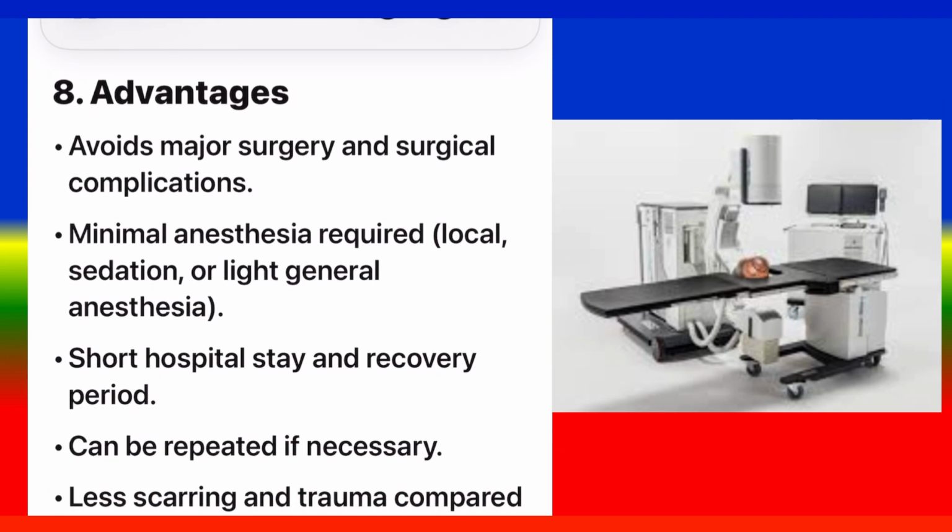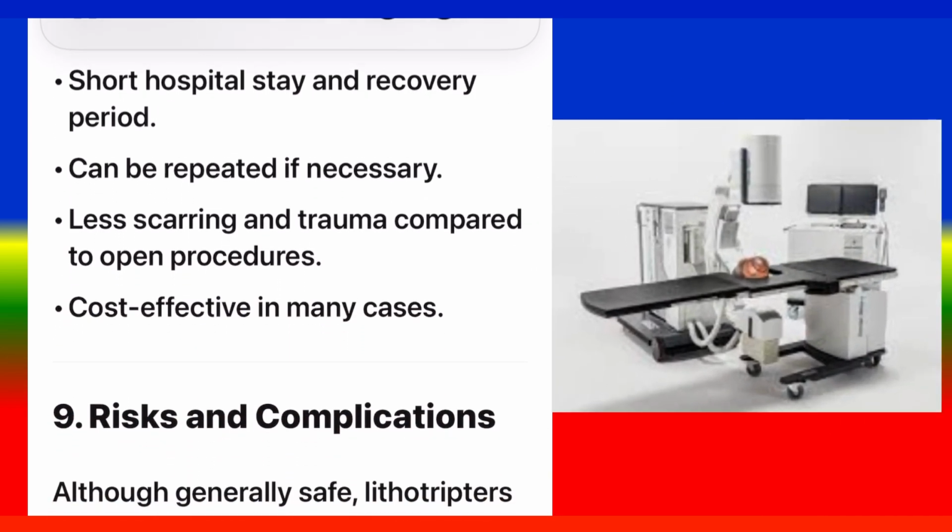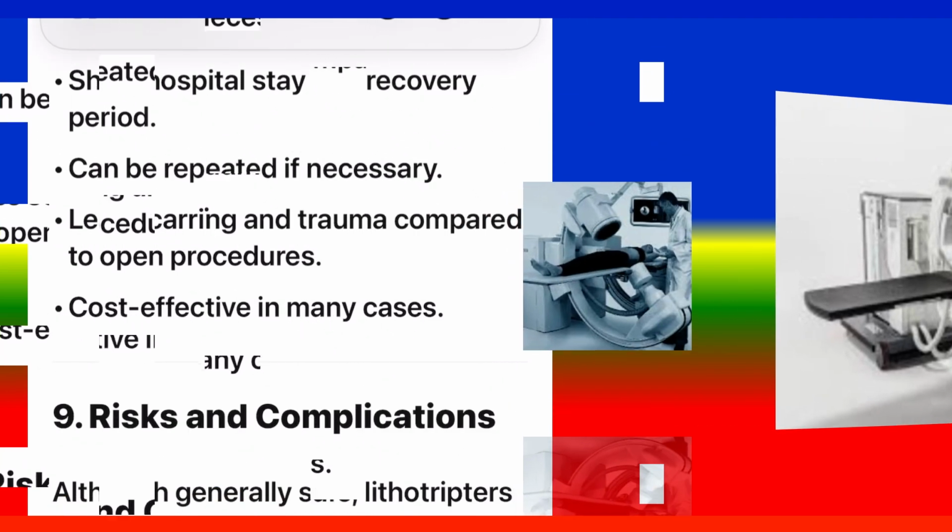8. Advantages. Avoids major surgery and surgical complications. Minimal anesthesia required, local sedation or light general anesthesia. Short hospital stay and recovery period. Can be repeated if necessary. Less scarring and trauma compared to open procedures. Cost effective in many cases.